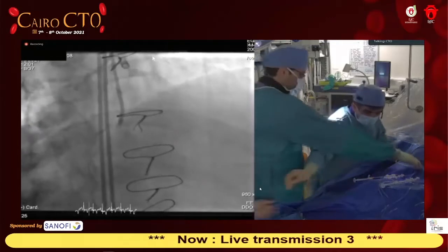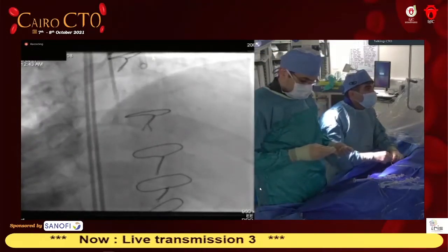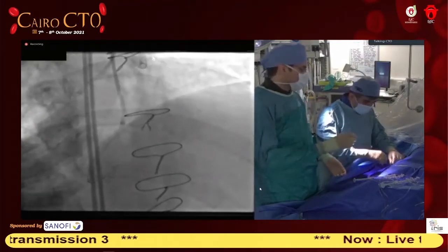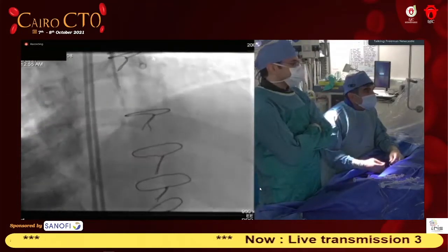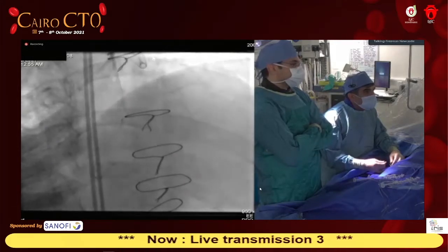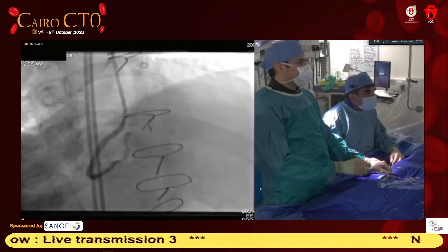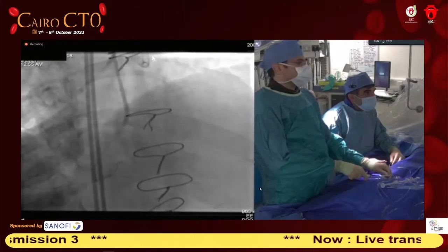In this situation, who would just stent the ascending part of the branch before the bend, and who will extend the stent beyond the bend, because there will be a lot of difficulties in doing this? There'll be a long wire here. Can you have a cyan black handy? Testing. Okay. We have equal votes for stenting just before the bend and after the bend.